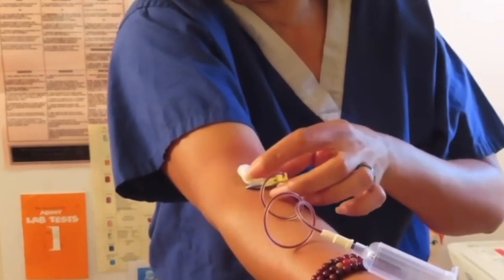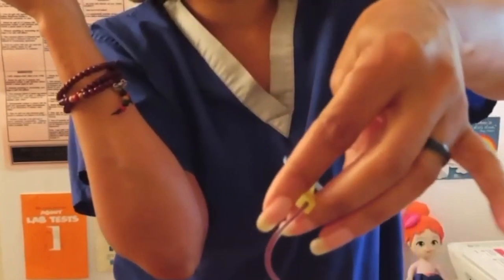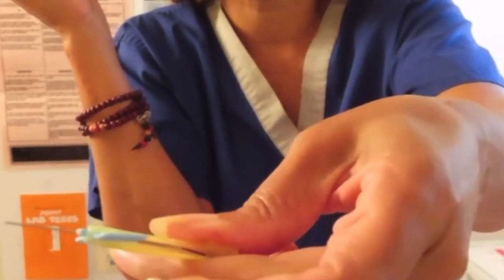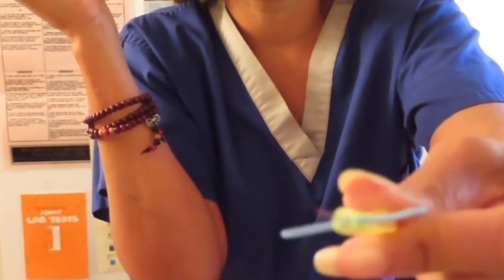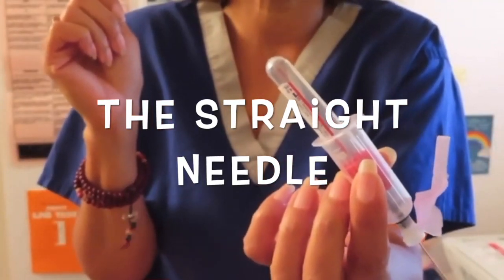I'm going to go ahead and remove this needle. It also has a safety device on it. It is a one-hand gesture. So with your safety lock, of course, this little yellow part is the lock, and it just slides right up. Drop your tube in your hub. Just let it sit there, no puncture. This is my method. I let it sit there.